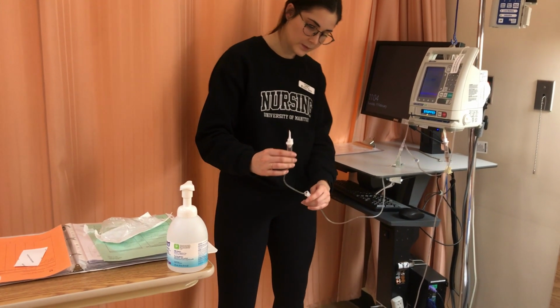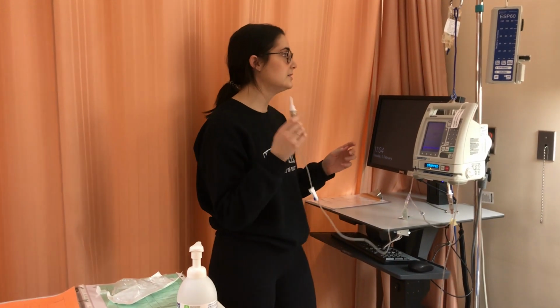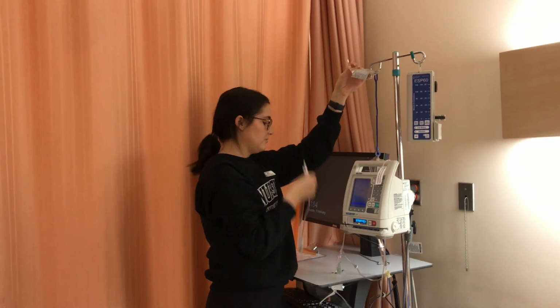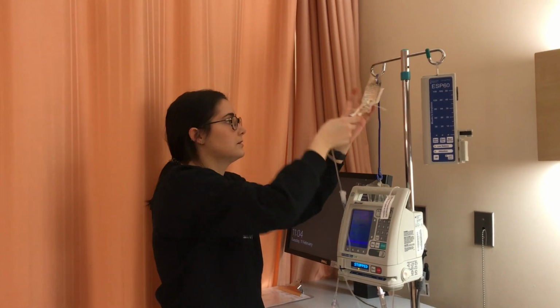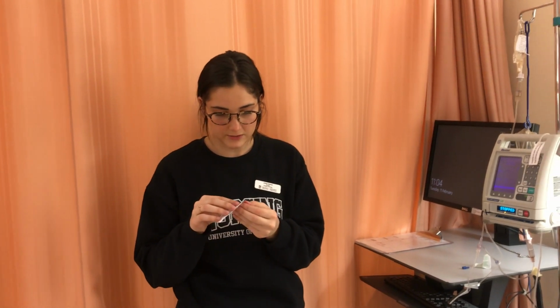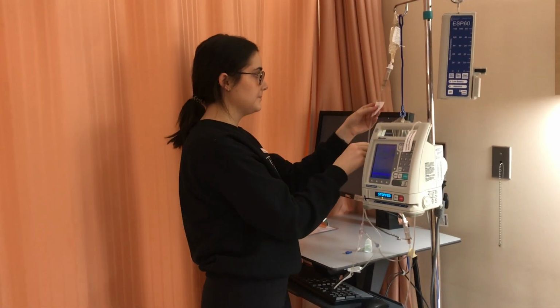Okay. So now that that's filled, I'm going to remove the spike, the coating on here. It's sterile. I'm going to remove that. Make sure not to touch anything with this. I'm going to spike my bag. And I'm going to label my bag. So I have my label here that says the date and the time and my initials for when I last changed the secondary line. So I'm going to wrap that around here.